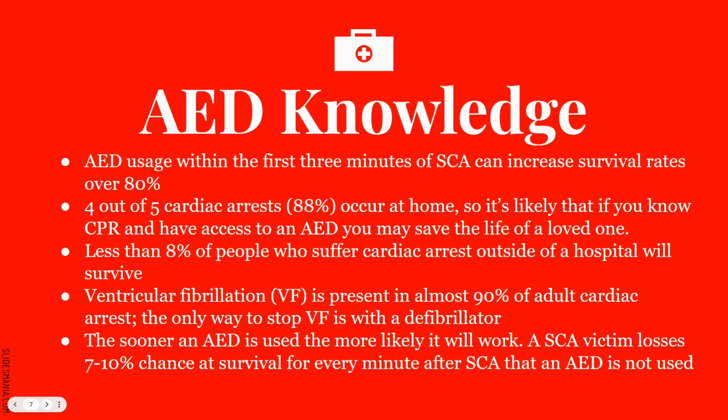AED knowledge. These are some interesting facts. Think about AED usage within the first 3 minutes of an SCA, which stands for sudden cardiac arrest. Within the first 3 minutes of a sudden cardiac arrest, the use of an AED can increase the survival rate to over 80%. So basically, identify the signs and symptoms of somebody having a heart attack and have an AED readily available. So when they pass out or when their heart stops, you connect the AED or you begin CPR. They have a higher survival rate of 80% or more.